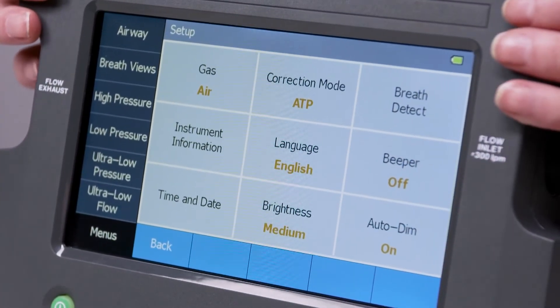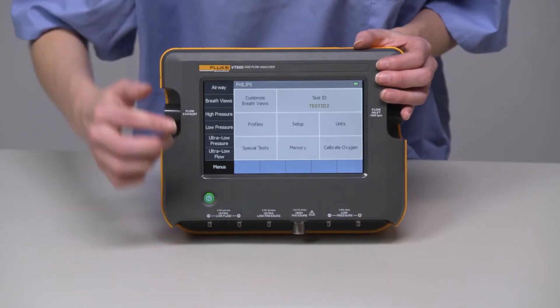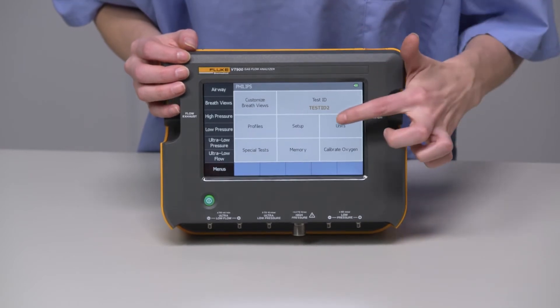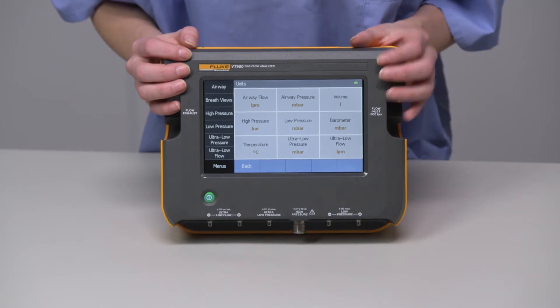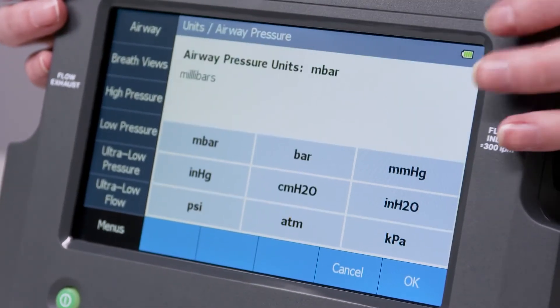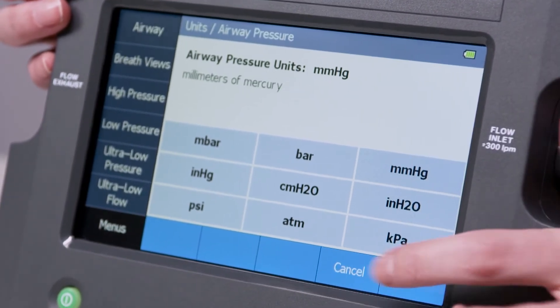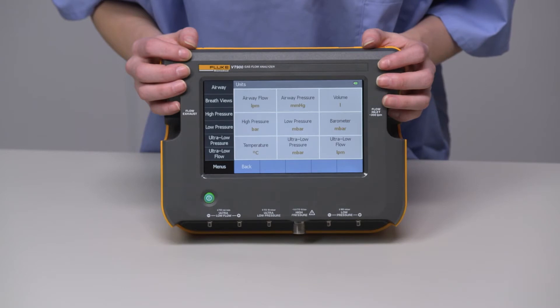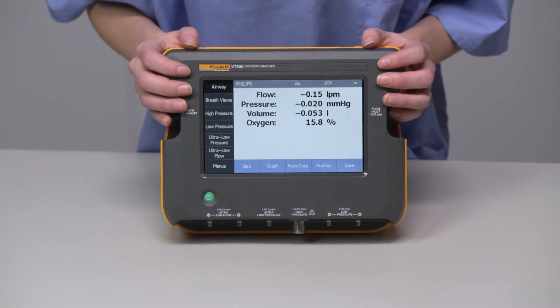To go back to the menus, either click Back or select Menus again. Let's look at the Units menu. Here you find the parameters of testing and can change units of measurement. For example, let's change airway pressure from units of millibar into millimeters mercury. Click OK. To see what we've done, we can press a measurement screen on the left, like Airway Channel, and we will see the change we've created.